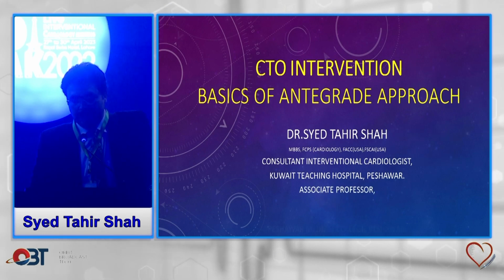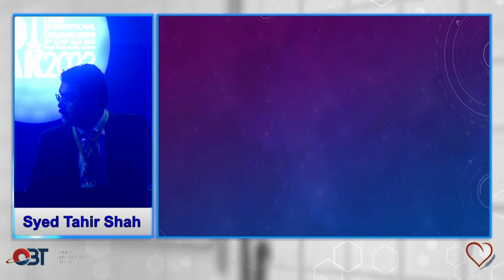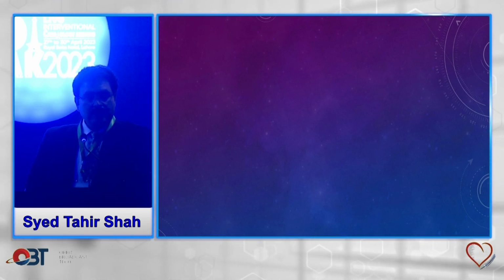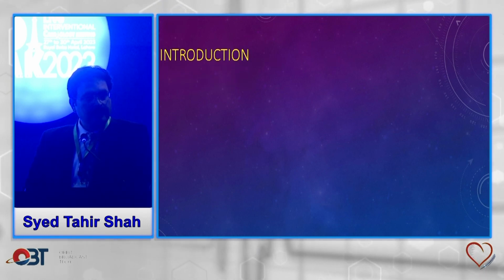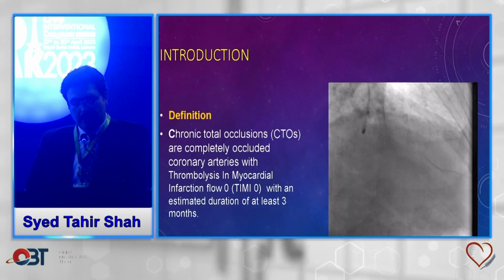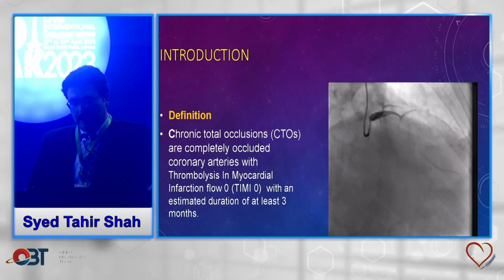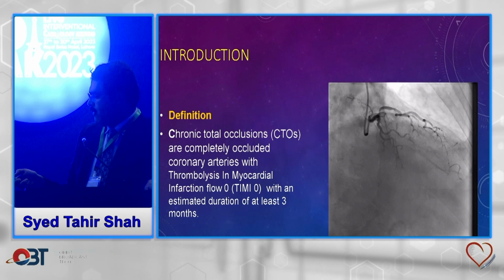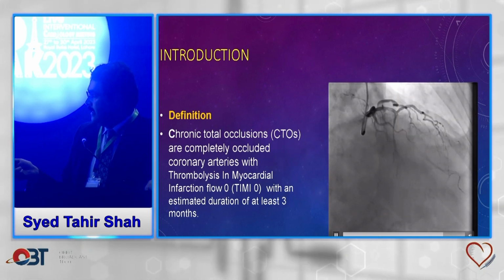After having a detailed discussion by Salman Arain on toolkit, I'm going to talk about how to approach a CTO and playing with the toolkit. So CTO by definition, it's a total occlusion, which is 3 months at least. This is LAD CTO, which is visible, mid-LAD CTO.